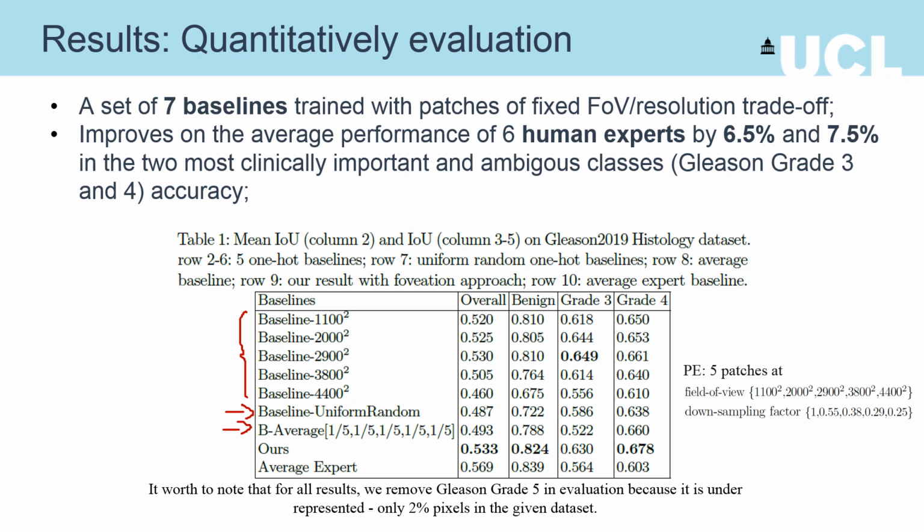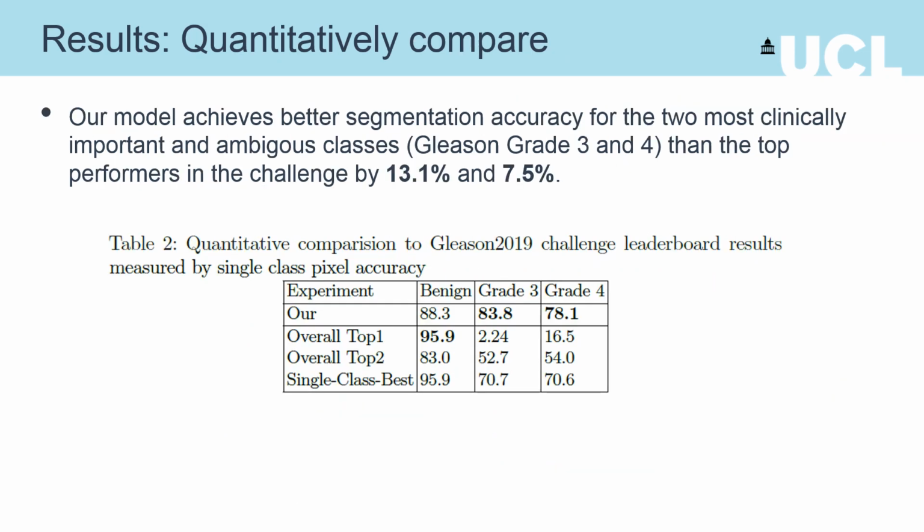We have also compared with the average experts' performance and also achieved superior results in the 2 most clinically important and ambiguous classes. And we also compare our model against the top performing results on the leaderboard and also achieved superior performance in the 2 most clinically important classes.